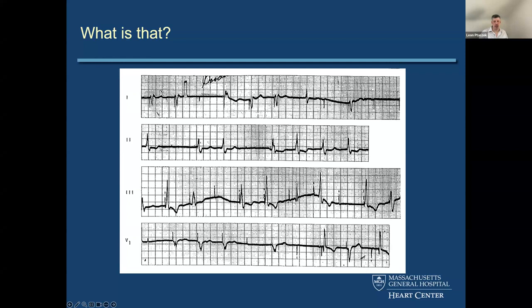Then you've got some capturing. This QRS complex looks a little different from that one. I suspect there's fusion between a native beat and the paced beat here, maybe because this is the timing of the patient's inherent escape rhythm, and it collided with the successful pacing spike. Then you've got some more pacing spikes. Another one that didn't come in. Here's a native escape, it seems. Here's another beat that didn't conduct. Again, you can make an argument that maybe this was refractory, but it certainly is a long time for it to be refractory. Another successful pacing event, another failed pacing event.